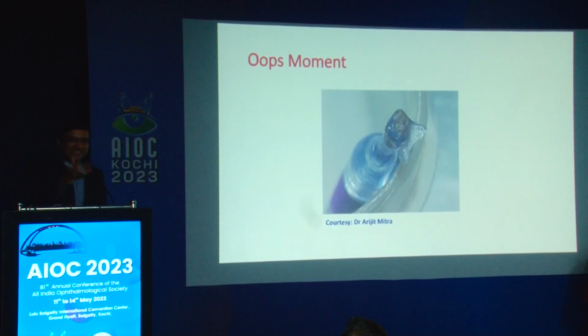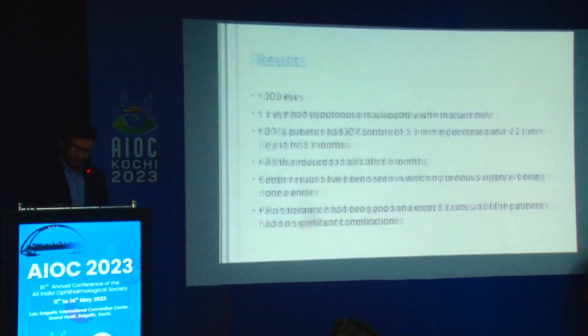You see that after doing it, because you have to pool the cases, you basically put in 7 cases and out of them 3 or 4 would respond, and you see that there may be some issues with the probe also. You can get a burn of the probe also. So whenever you have done the first case and you are going to go for a second case with the same probe, please check that the probe is not damaged.